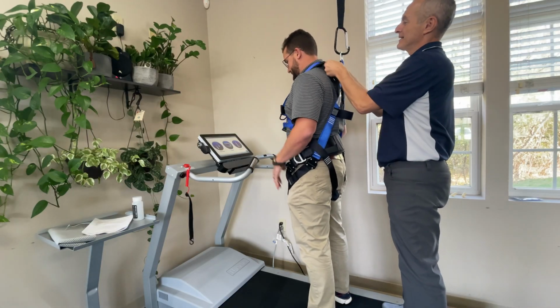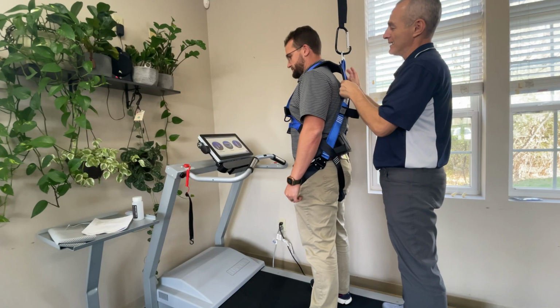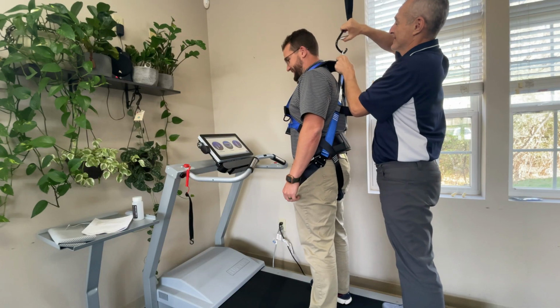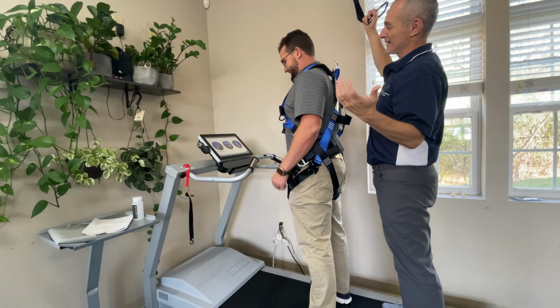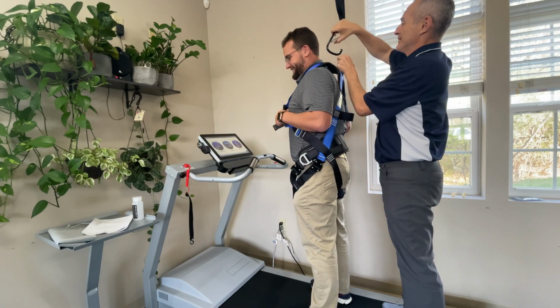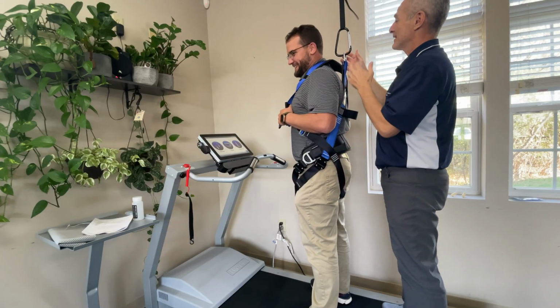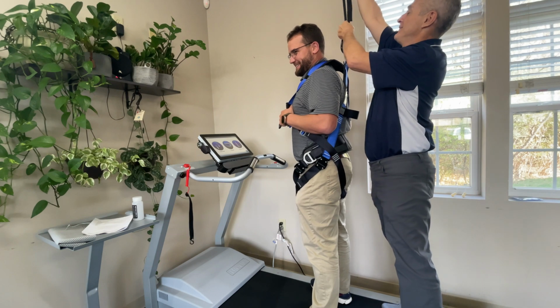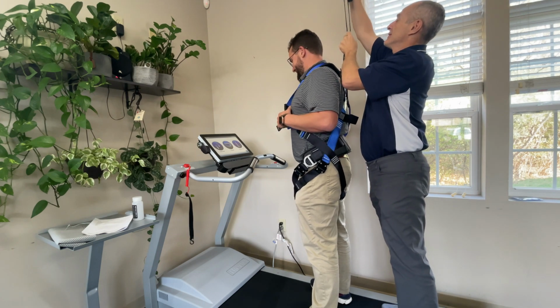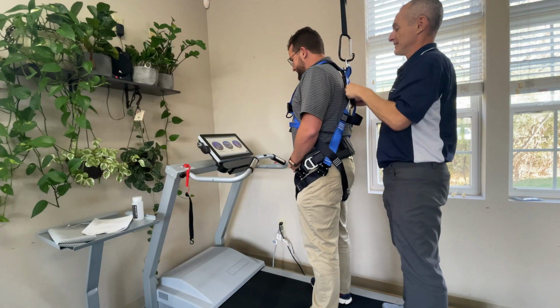So one thing that I noticed, this particular harness, we bought this harness separately. It's a heavy harness. If you just feel the weight of the harness, it doesn't feel like much. I've got a video coming out of a little lady who's probably 90 pounds. The harness itself felt heavy to her. So I adjust the vertical strap so it's good.